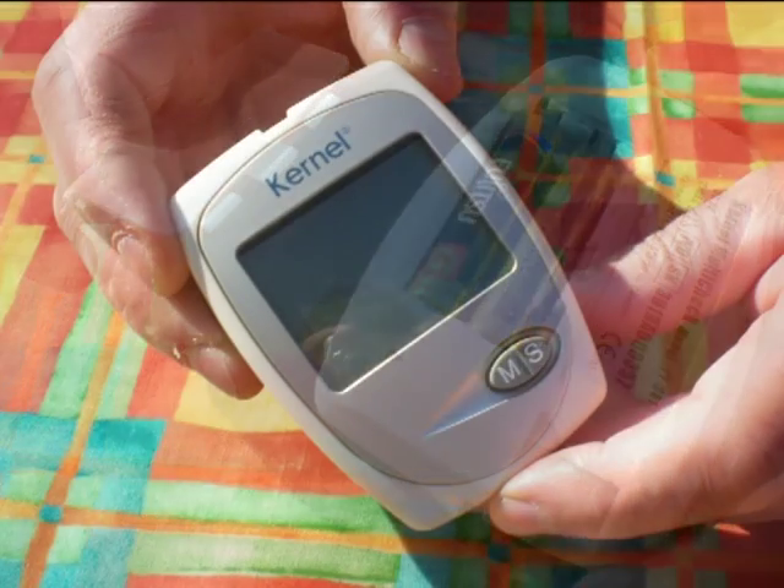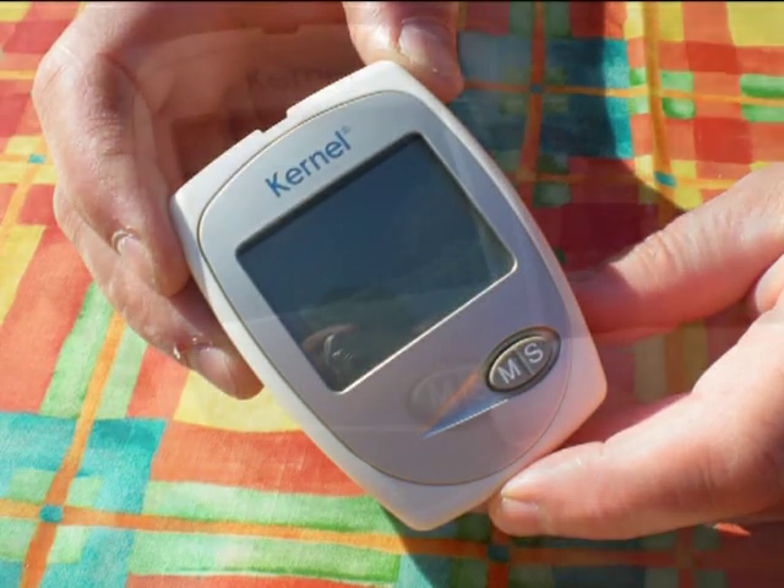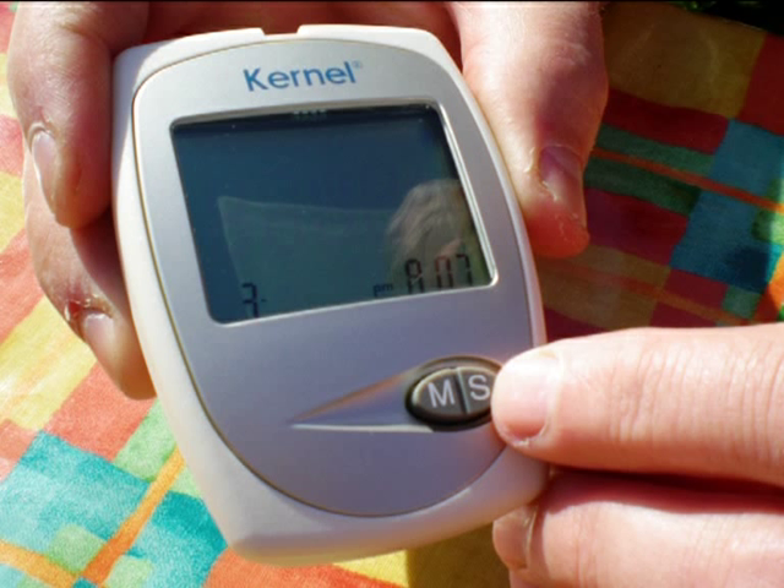Once you have done this, the first thing you need to do is insert the batteries. The meter will turn on automatically and you should then set the date and time. Starting with the month, press the S button until you have the right date, then press the M button to move on to the year. Repeat this step through the hour and minutes. Once you have done this, do not press the M button again. Instead, wait 30 seconds for the meter to turn off automatically.